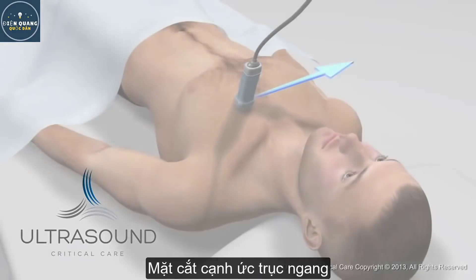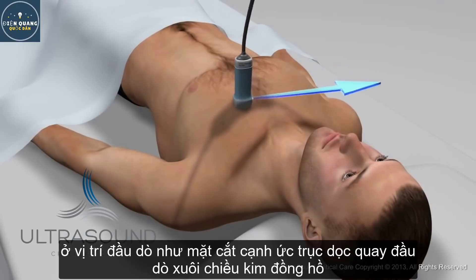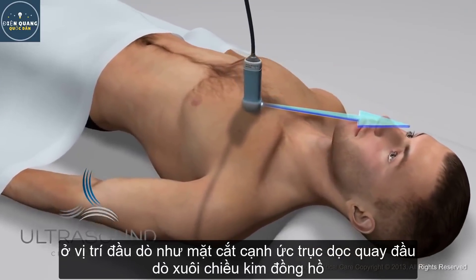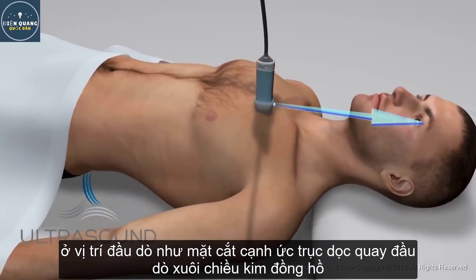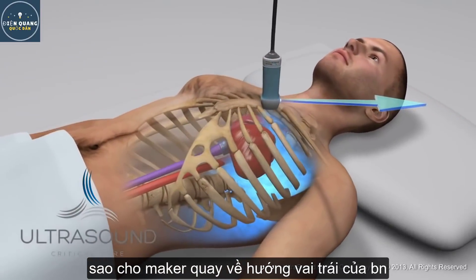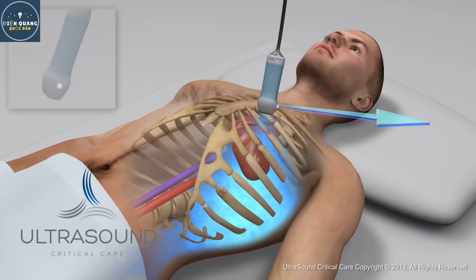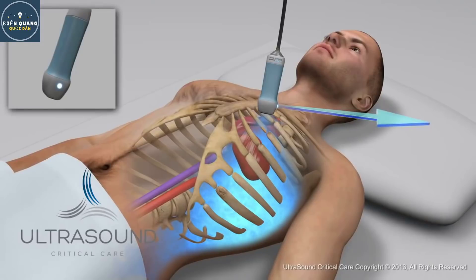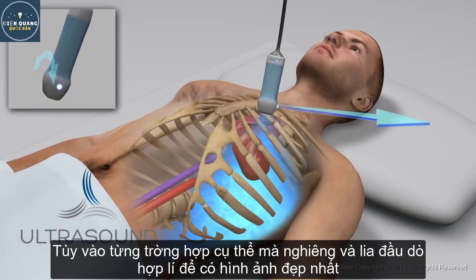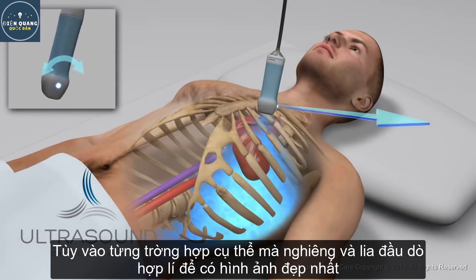Parasternal short axis view. Moving from the long axis positioning, you will now rotate your probe clockwise until the dot is directed towards the patient's left shoulder. Tilt and rock your probe to obtain the best view.